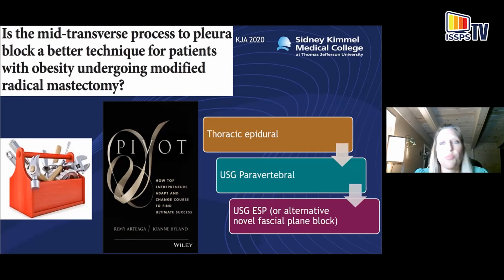But these techniques are really valuable in the obese patients. We really can't abandon regional anesthesia in these patients, because they can benefit the most from opioid sparing and improved analgesia. So I think it's important to think, don't get lost just because you're doing a thoracic epidural and it's not working and the ultrasound hasn't really helped you. Think about what else you can use and think about all the other tools in your toolbox. And you may have to pivot and change course when something isn't working.